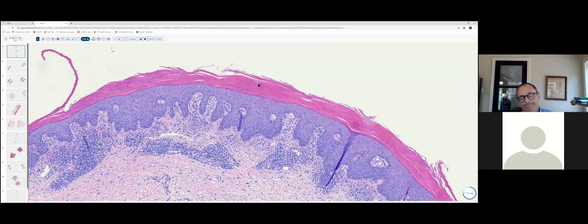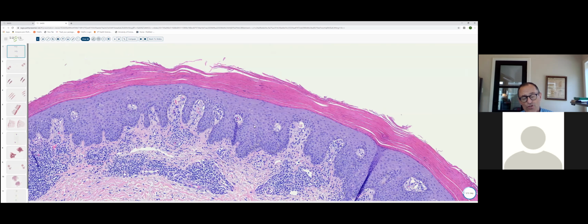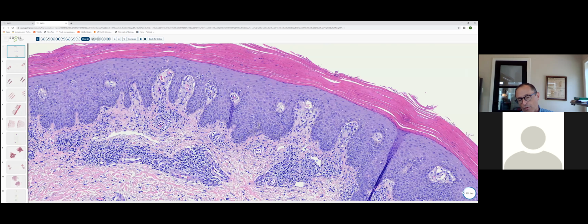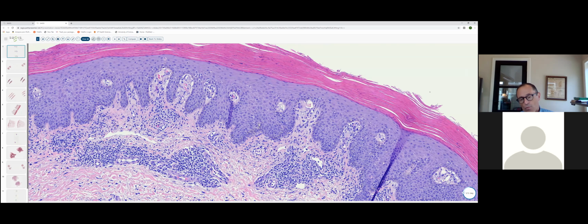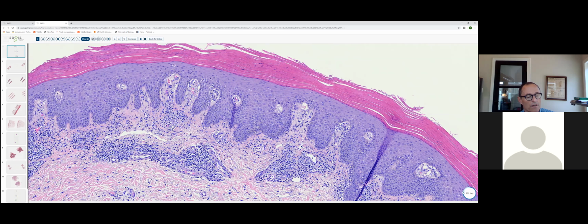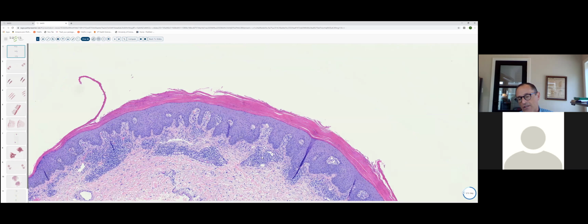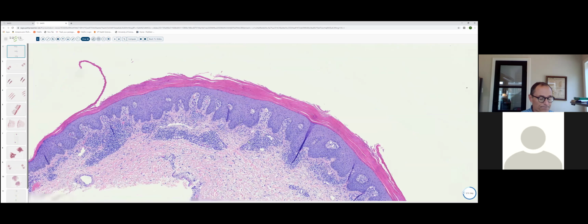In addition, there usually is some evidence of microscopic spongiosis. The intercellular spaces will frequently be a little widened, with some serum or edema accumulating between the intercellular bridges. Most eczematous dermatitides will also more often have a mixed cell infiltrate. Usually you can see a few eosinophils admixed with lymphocytes as well.